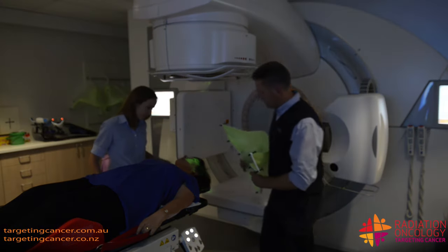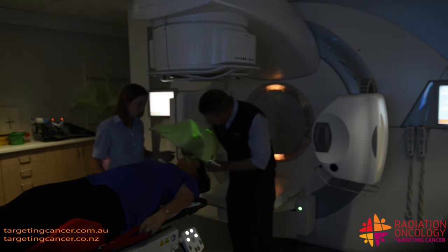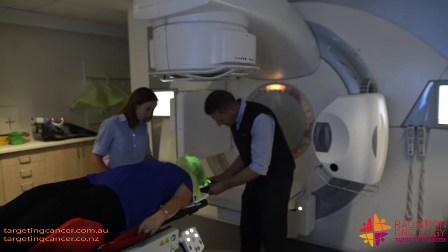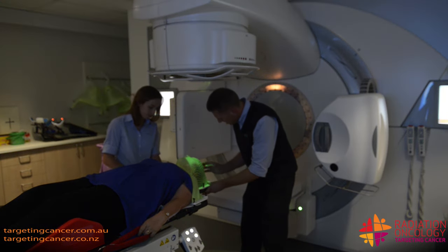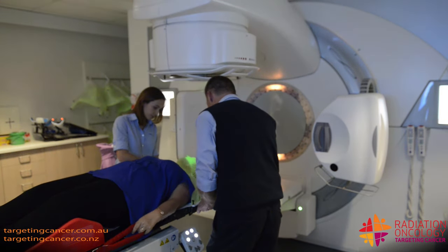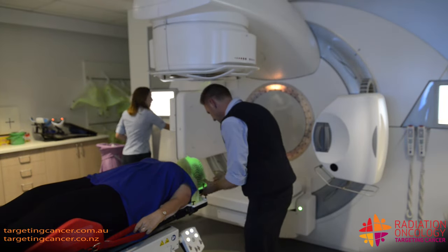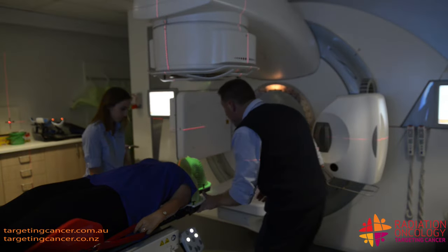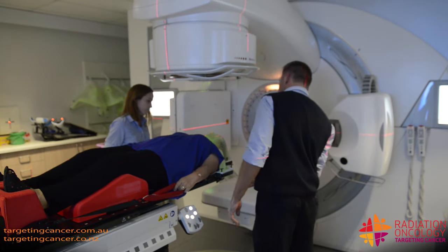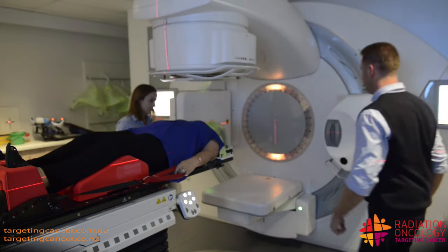Julie, we're just going to pop that mask on now, so just remember to breathe nice and calmly. Okay. How's that feel? Okay. I might just get you to wriggle up towards the top of your head just a tiny bit. Yeah, that's better. Perfect. Feeling okay? Mm-hmm. Alright.